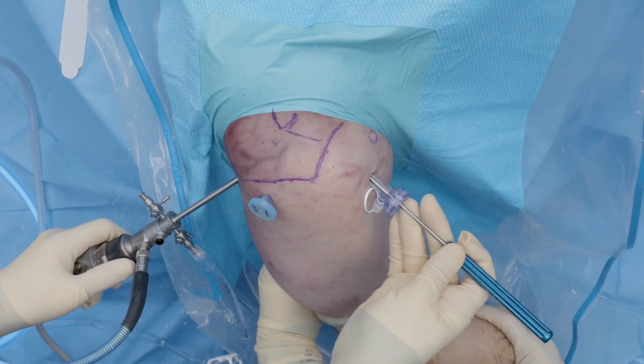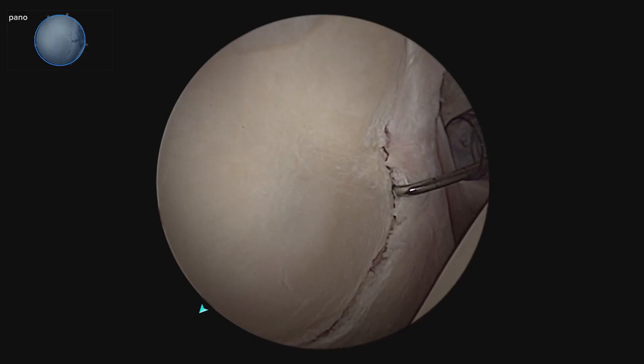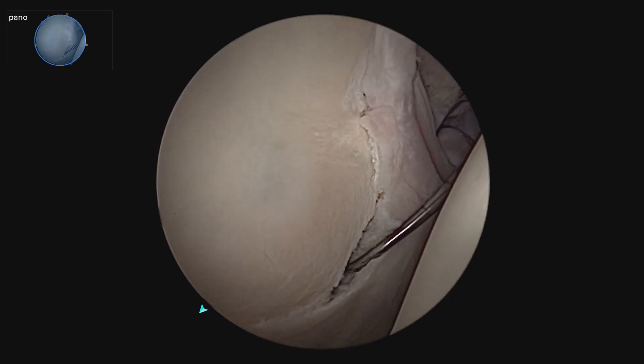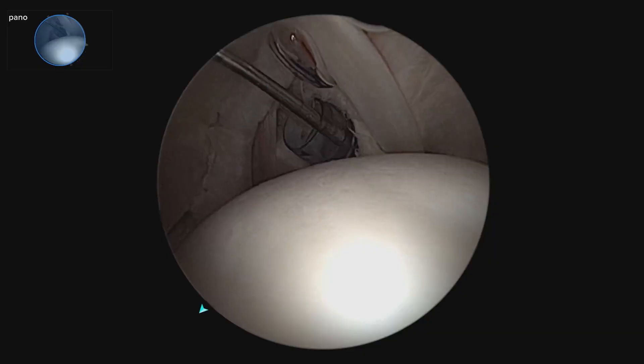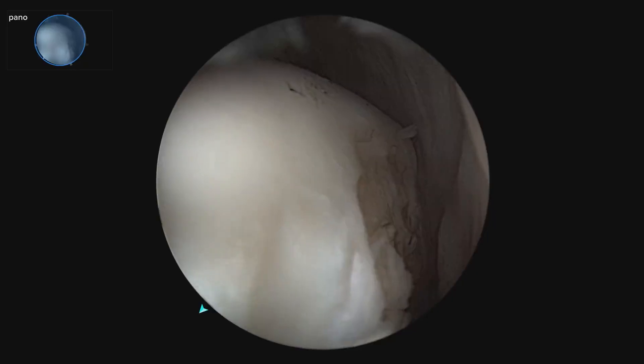On the specimen there is an anterior inferior labral tear going from about 3 o'clock on the glenoid all the way down to 6 o'clock with a loose labrum. As we pan around the humeral head, we see the corresponding Hill-Sachs lesion.